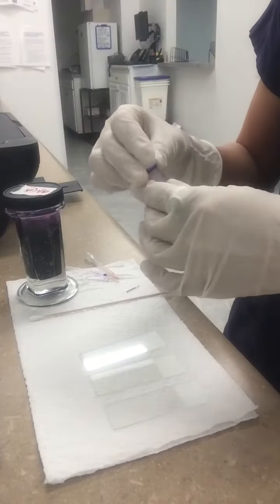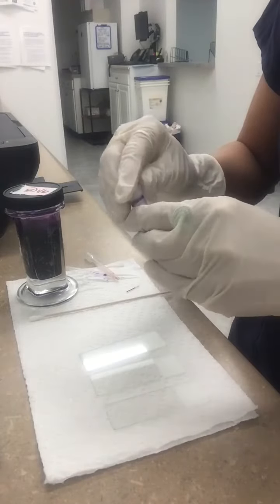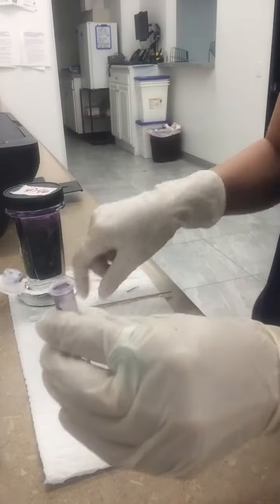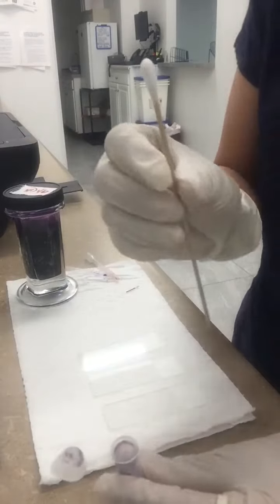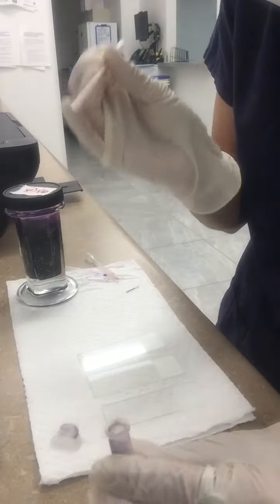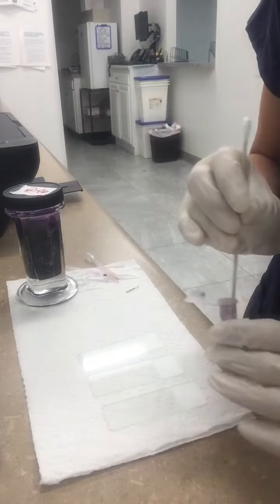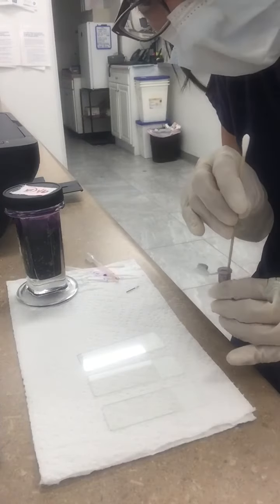We have our sample here. What we're going to do now is open it up, and I'm going to take a cotton applicator stick and dip right on in. As you can see — it's kind of hard to see — I have three slides.